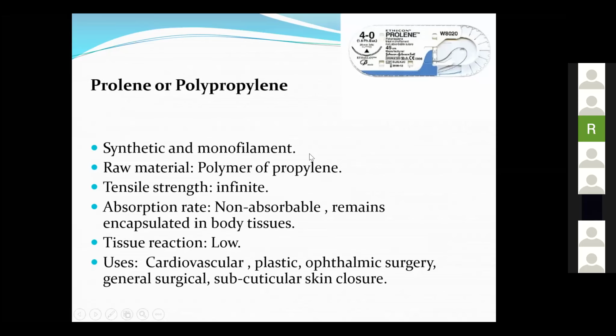It is monofilament and non-absorbable, and it has a very low tissue reaction. But again, as we said, it is monofilament, so it glides through the tissues very easily, but knot tying is difficult, so you have to apply many knots to secure them together. So 9 to 11.